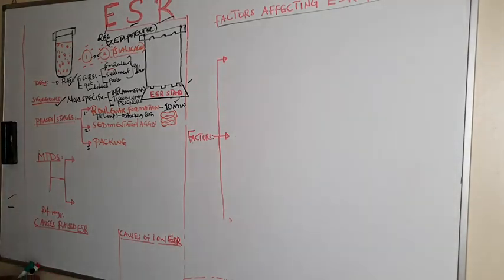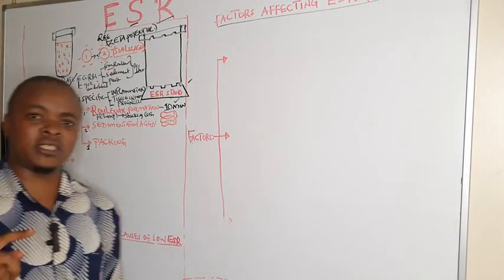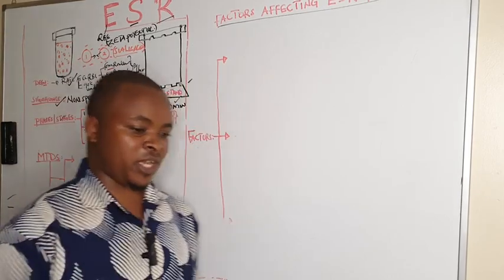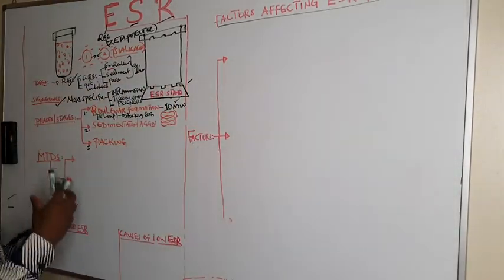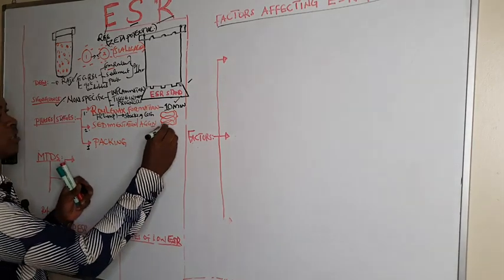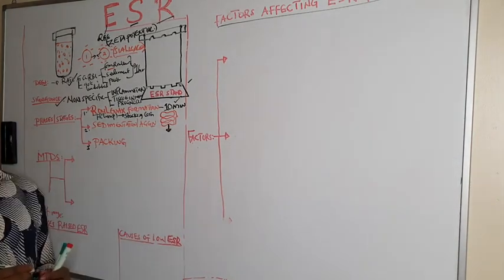After that, we go to the second step, which is sedimentation, or what we are calling aggregation. When the cells have come together like stacks of coins, they begin to fall in a tube towards the bottom.